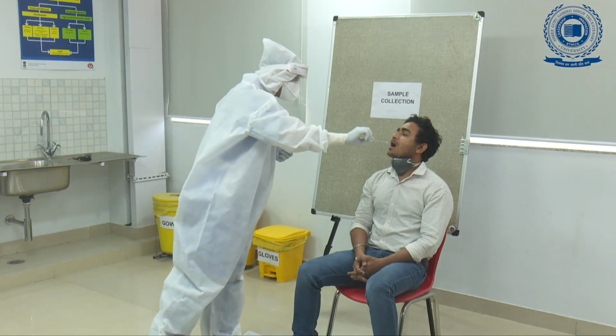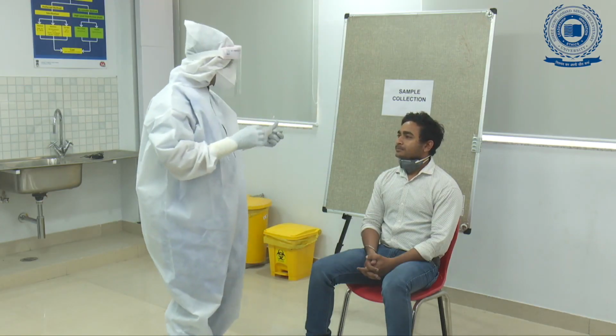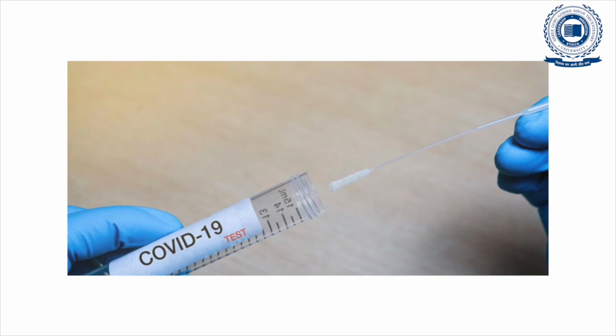For collection of throat swab, the swab is entered into the mouth. Tonsillar arches and the posterior pharyngeal wall are swabbed. The swab is removed from the mouth and it is entered into the viral transport media, broken at an appropriate height and sealed.